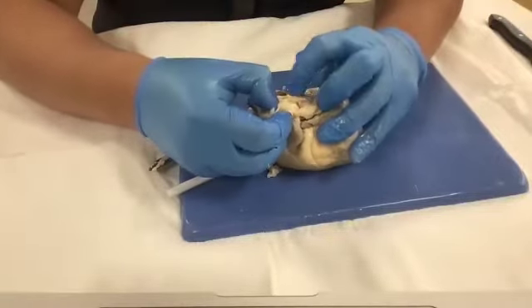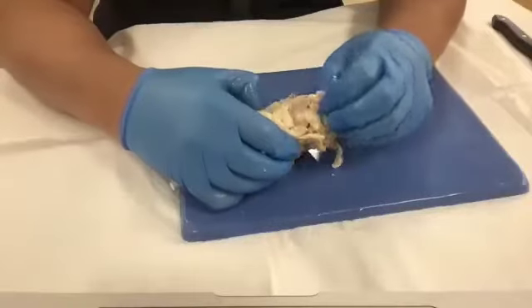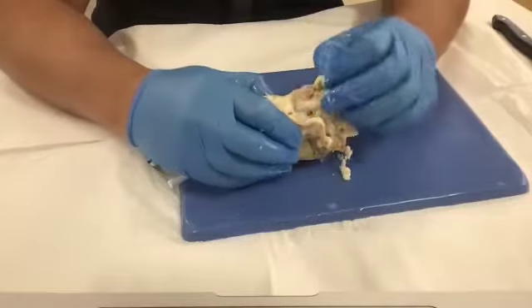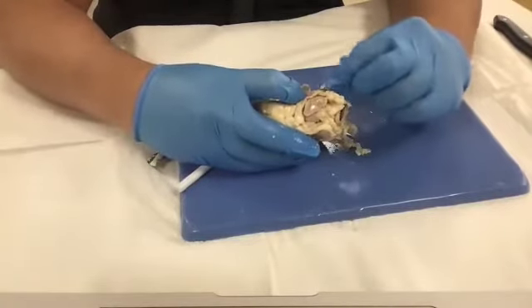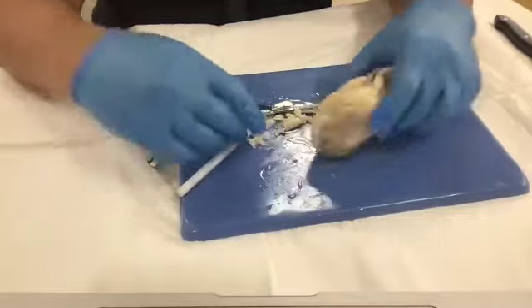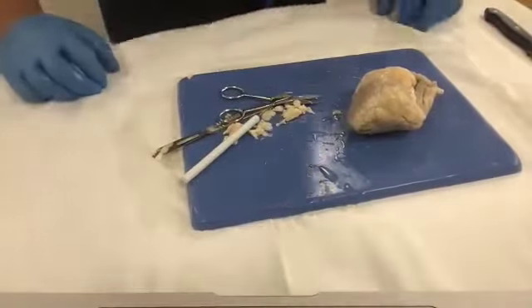Now let's try to see a larger venous structure if we can. Let's see if I clean this up. Okay, that's part of the aortic arch. Trying to find either your superior or inferior vena cava. And now it's hard to find. But let's look at a model. All right, I'll be right back. Let me get a model.